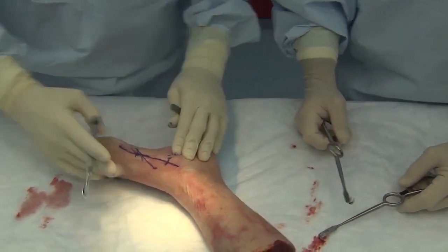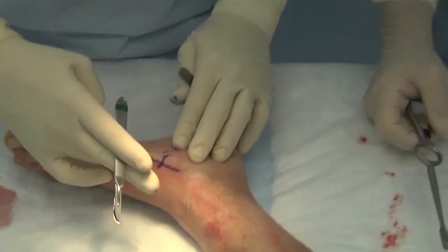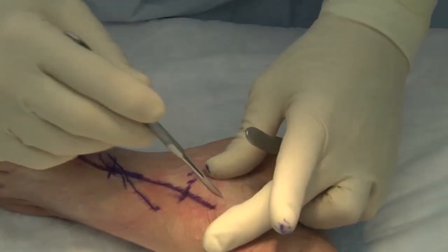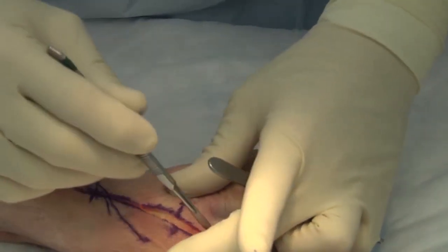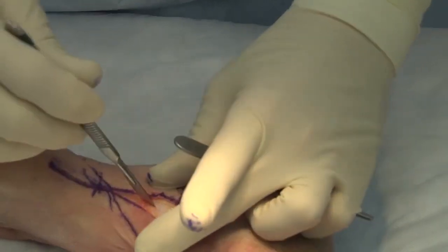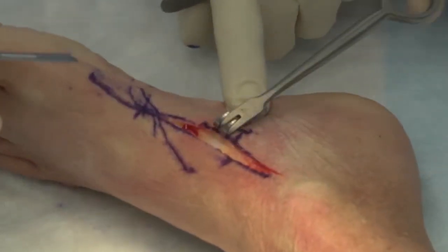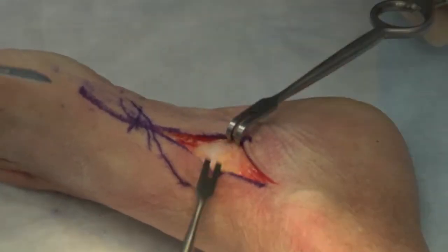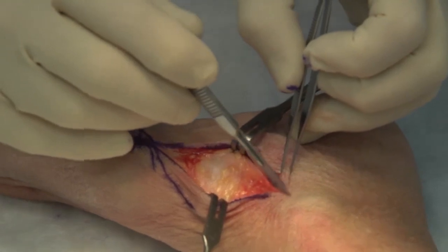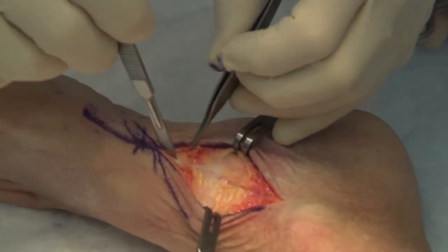There really isn't much to worry about here. You have the saphenous vein coming down and there are some terminal branches of the saphenous nerve. But this incision is a very safe exposure. There are some crossing veins that will interfere, usually running from the dorsal side to the plantar side, and we can bovie those as we meet them. This can be a sharp dissection done in a relatively expedient fashion.